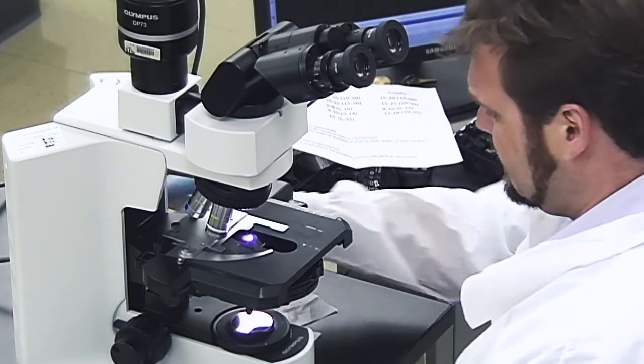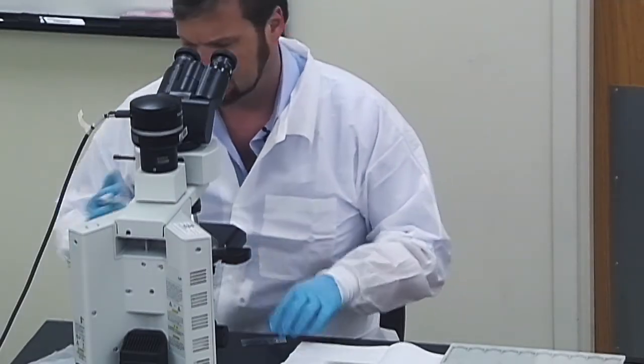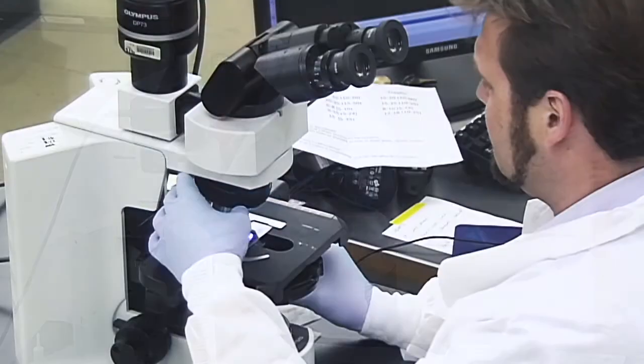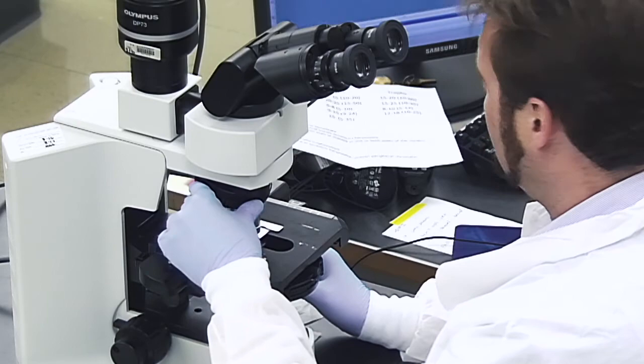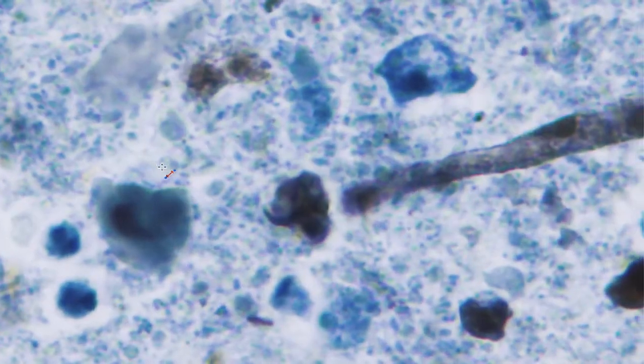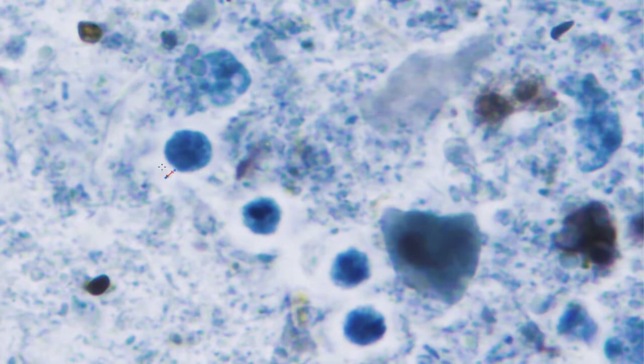What I'm going to show you next is a slide stained with an iron hematoxylin stain. I'm fond of modified iron hematoxylin, but it's not popular here. So we in DPDX use trichrome. Why I'm showing you this is a few things. It shows a lot of different protozoa, and I hope it'll help you see just how difficult it can sometimes be when you have multiple protozoa. And also there are cysts of Entamoeba hartmanni in here.